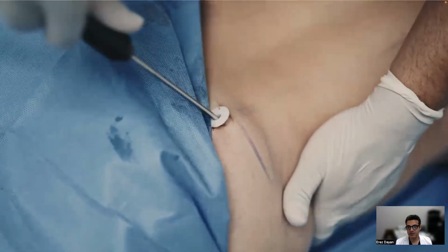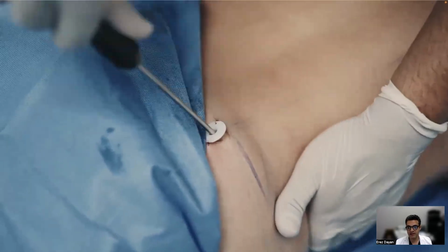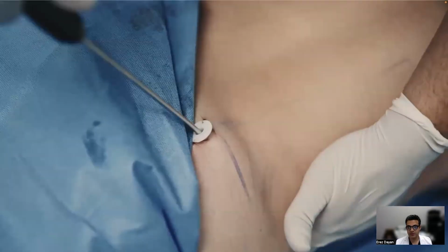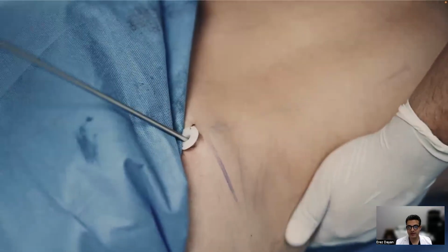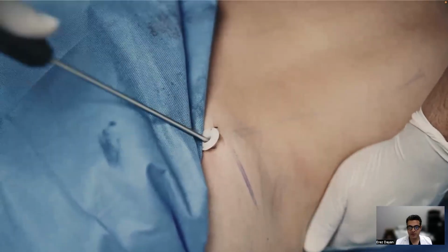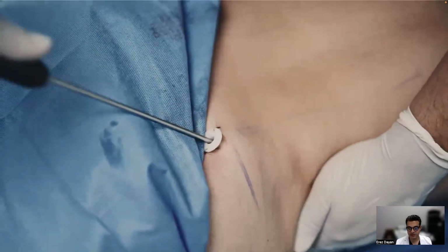So what I'm doing is I'm pushing the soft tissue into the cannula and allowing the cannula to do the work, and I'm fanning in order to remove the fat from the whole flank area using long strokes. I'm trying not to stay in the same position too many strokes. I'm fanning to equally remove fat from that flank area.